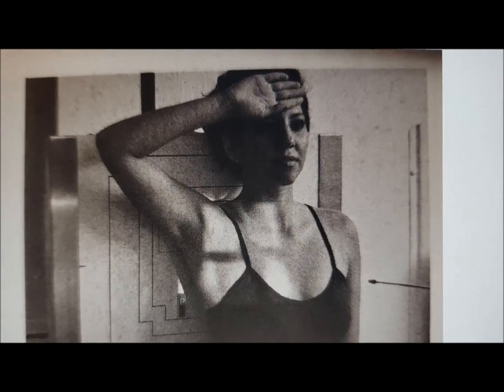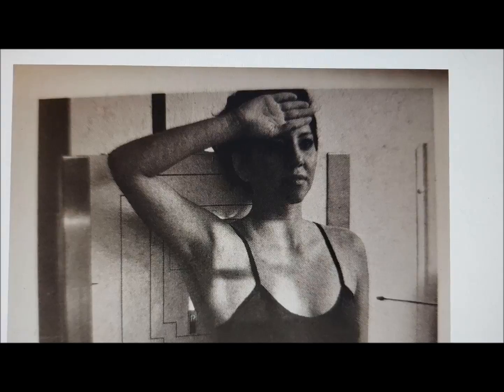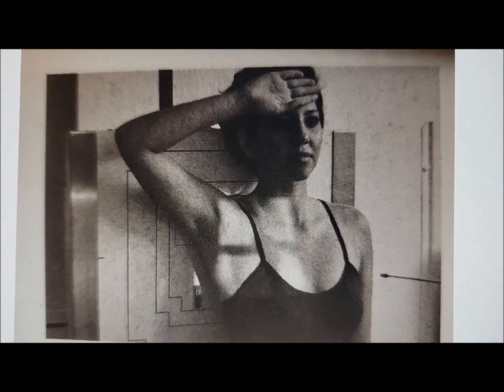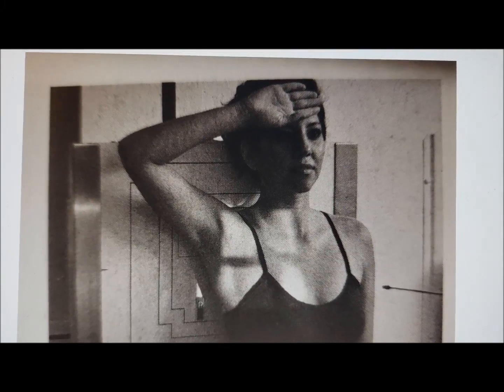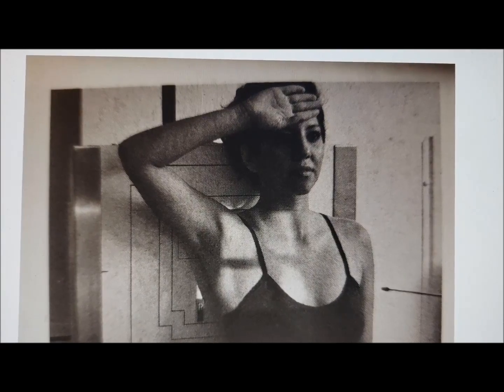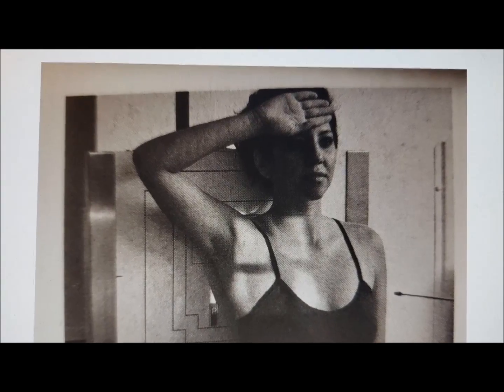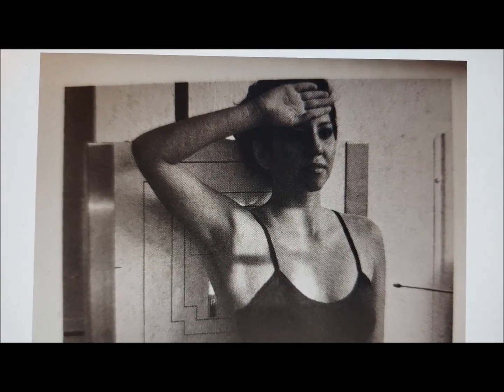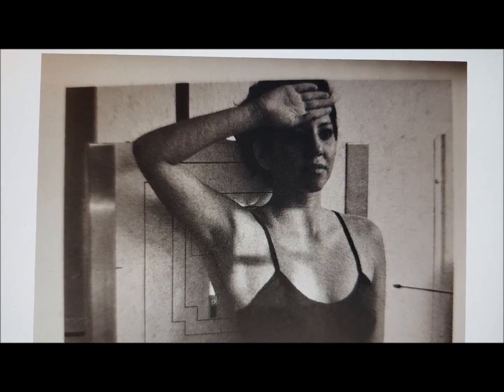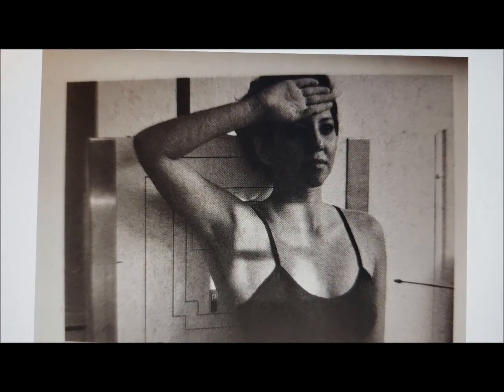Next, I'm going to talk about the positioning routine, also the trauma routine, and the positioning of the patient. Here in this image, we have an AP view of the scapula. This will demonstrate the entire scapula. The CR would be perpendicular to the mid-scapula, 2 inches inferior to the coracoid process, and 2 inches medially from the lateral border of the patient. You will ask the patient to abduct the arm 90 degrees and, if possible, supinate the hand. Center the IR to the entire scapula.